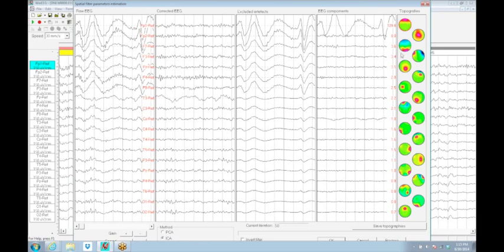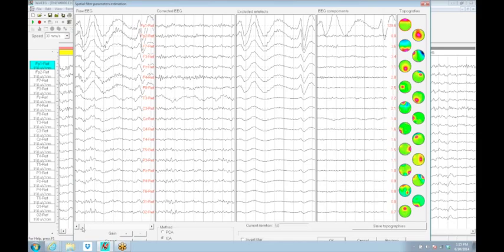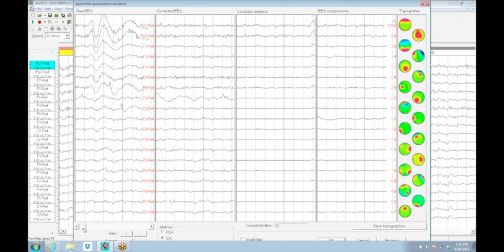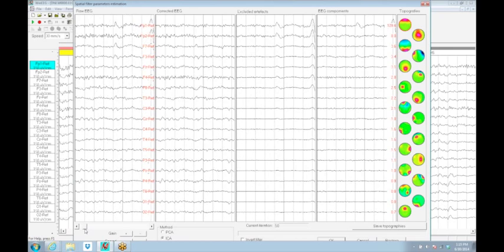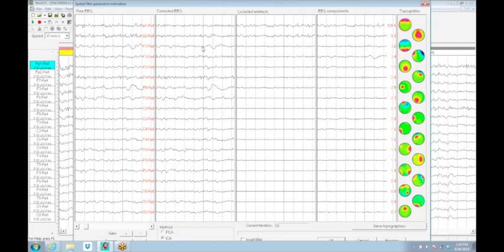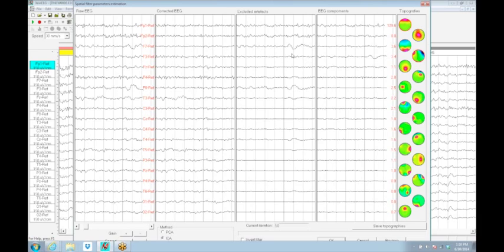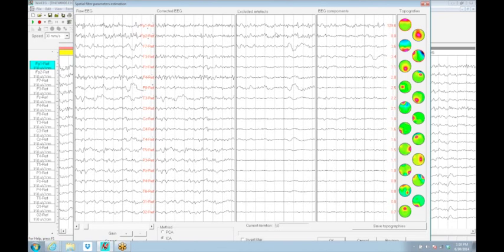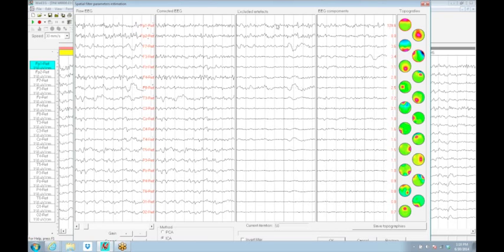As you drop down, you'll notice there's an F7, F8 opposite of each other as a display here in the topographies. This will be lateral eye movement. If we scroll through the EEG to the point where we see a lateral eye movement, we'll probably be able to identify it here, F7, F8 going opposite of each other. This is the lateral eye movement component, and it pulls out the lateral component. Also, T3, T4 were going opposite of each other, the same dipole all the way back. The eye movements being taken out include the large eye movements of lateral eye movement and all of the small saccadic movements of the eye as well.